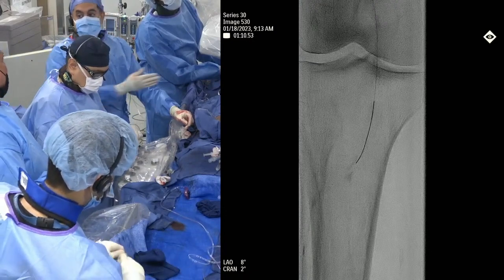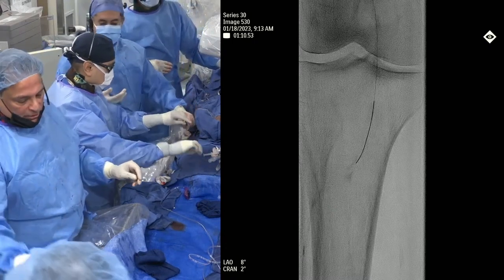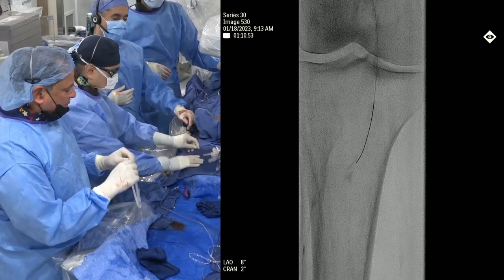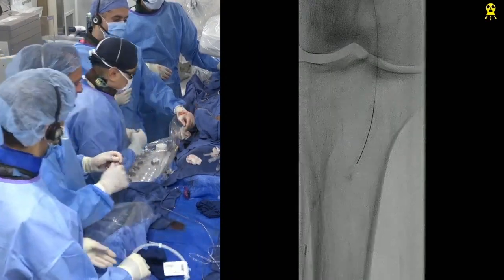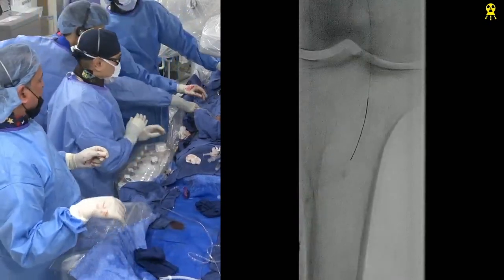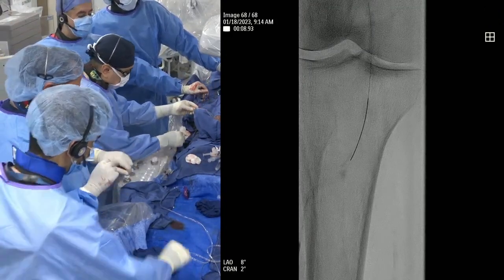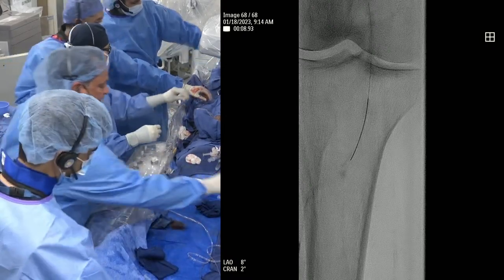Usually we're always talking about an area that was already ballooned. What are you doing? You told me catheter is down there. Yeah, but I'm saying you don't push with a loop. Why we're arguing here is that you cannot push through a loop in an area that's already been ballooned. So that's something you don't do. So I think what we need to do is get this catheter up elegantly. We've definitely crossed from above. And now we need to elegantly get this catheter, and then wire into it. Pushing with a loop is... and if you create a flap from above, then you're in trouble again. So we just need to be very, very gentle in these kind of cases. I know everybody's excited about crossing, but the idea here would be to now finish the case.